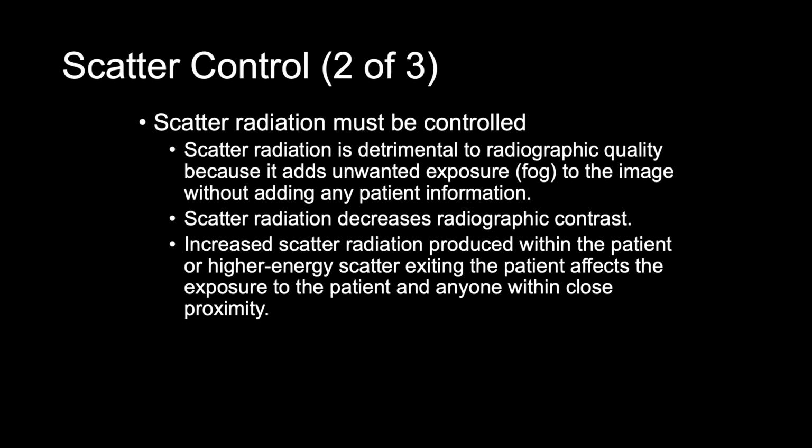Scatter radiation must definitely be controlled. Scatter radiation provides no useful information about the anatomic area of interest. Controlling the amount of scatter radiation produced in the patient and ultimately reaching the IR is essential in creating a diagnostic quality image.